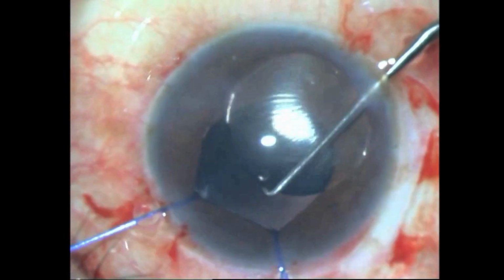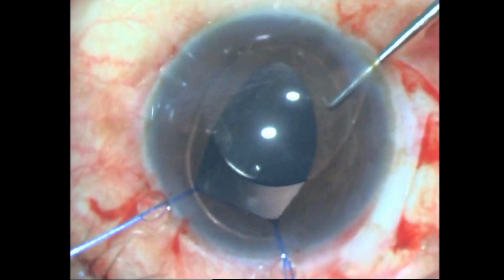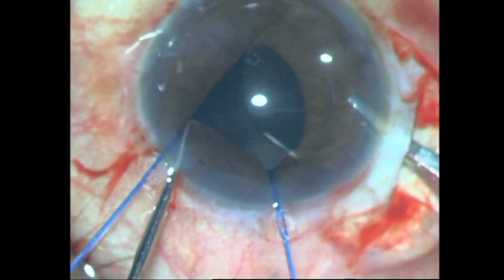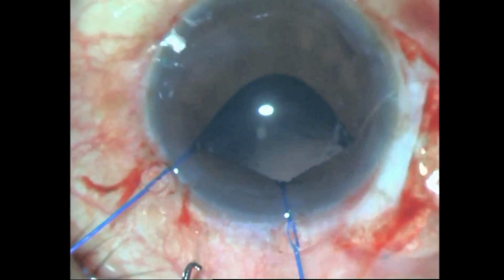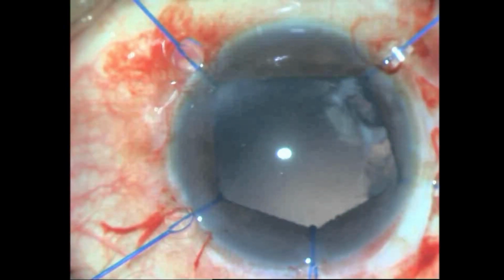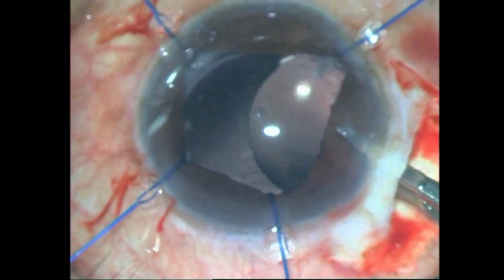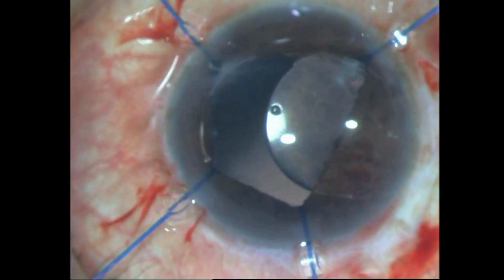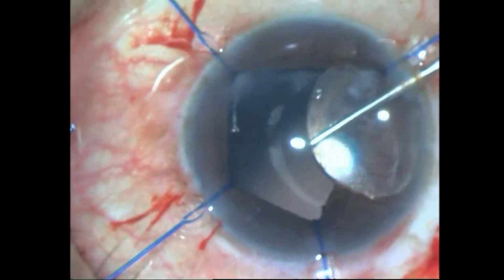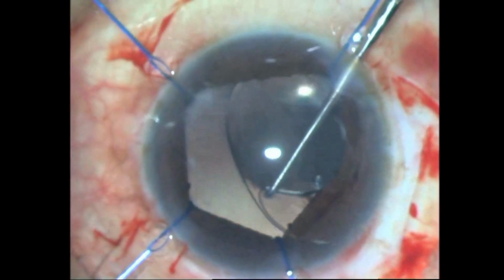I was not very sure of the status of this IOL and hence I removed it, put in some more iris hooks to visualize the periphery, and I could see some calcified peripheral bag, and I thought probably there is a deficiency superiorly. So I put in another lens using that peripheral PC as a scaffold and making sure both the haptics were placed horizontally, completely away from the presumed superior deficiency of the bag.